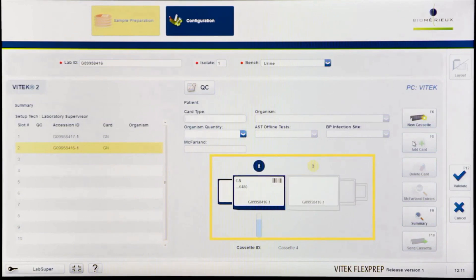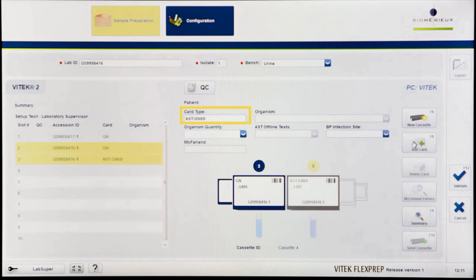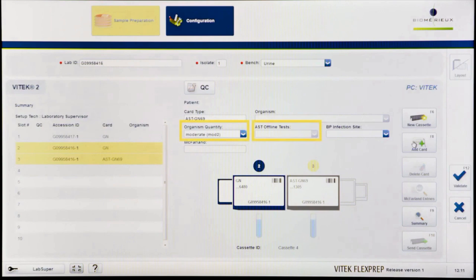Fill the card type field for the AST card by scanning the AST card barcode number. Enter any desired additional information such as organism quantity or AST offline test.